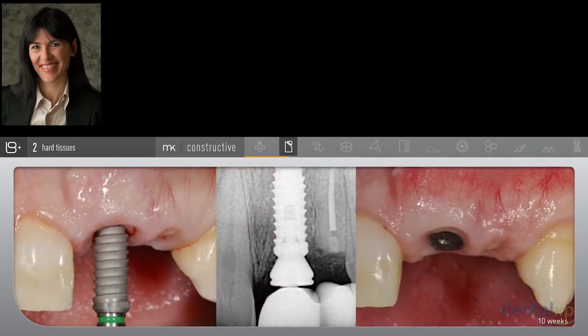Now, my key, from a surgical standpoint, is I have to think about what this does for my restoring colleague at the end. That means I really have to think about restoratively driven implant placement, putting the implant in a position where we can think about a screw-retained restoration for the purpose of retrieval, should we need to reaccess that lateral incisor which has been submerged.